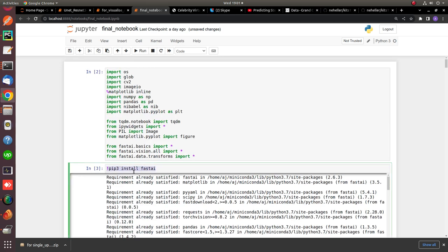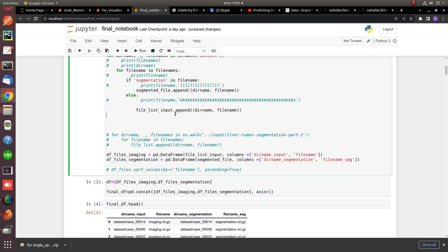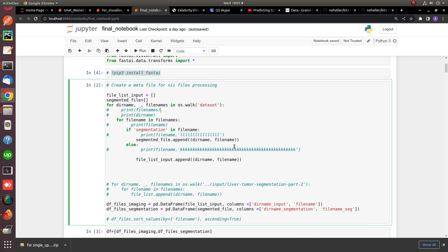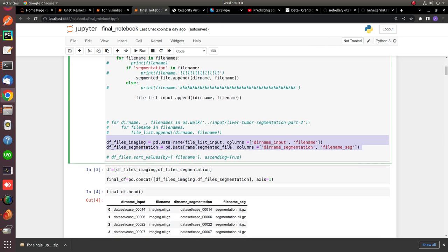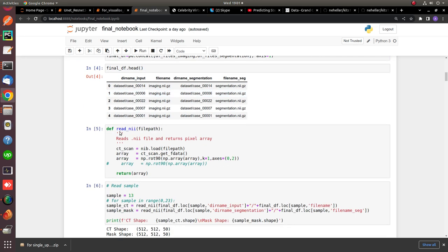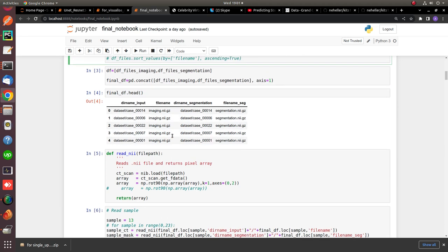Here I'm loading the dataset. My entire images are available in the dataset folder, so I walk through the dataset, get the names, and write those images into a CSV file by converting to a pandas DataFrame, which consists of the directory name, the file name, the segmented directory name, and the segmented file name.